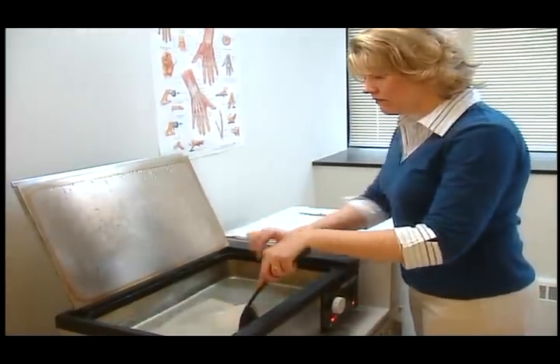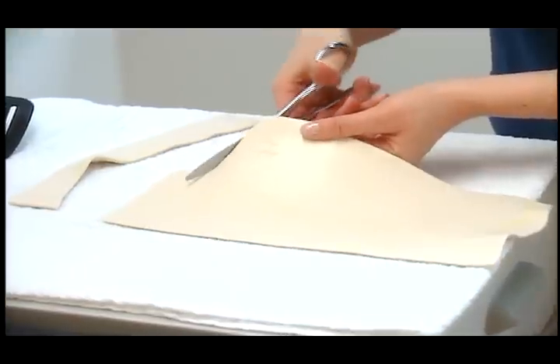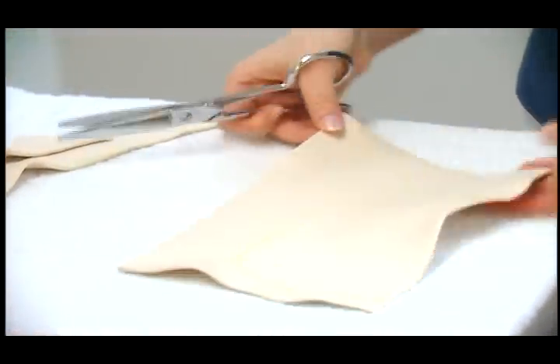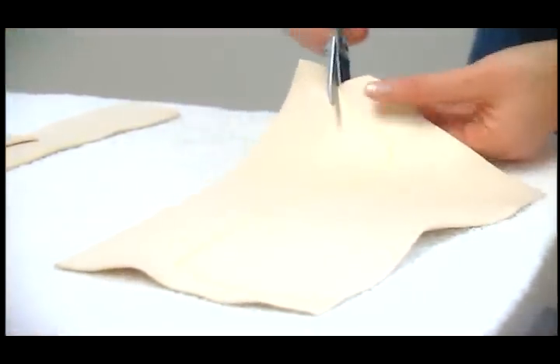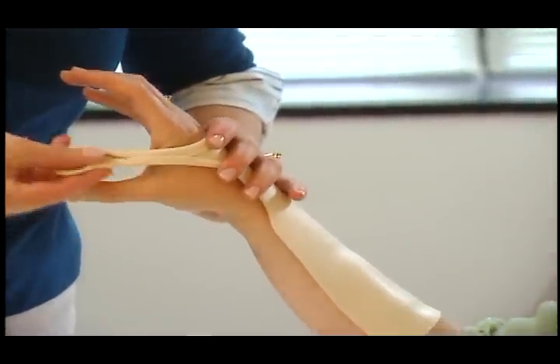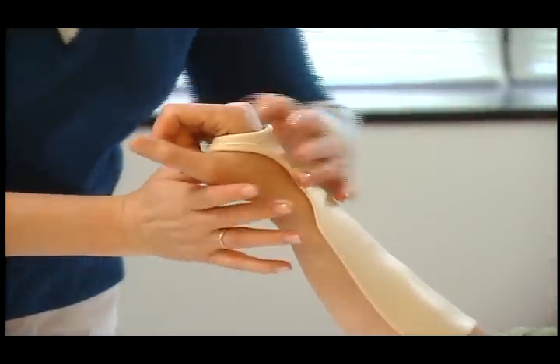Remove it from the water with a spatula or tongs. Use a sharp, straight-edged scissors to cut the material along the traced pattern. Remember to hold the material horizontally while cutting to avoid overstretching it. Before forming the splint on a patient, always check the temperature of the material to ensure the patient's safety and comfort. When using a material with draping qualities, it is best to position the patient so that gravity can assist as the splint is forming.